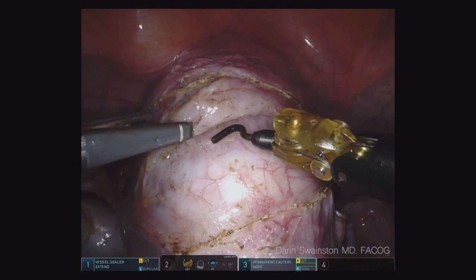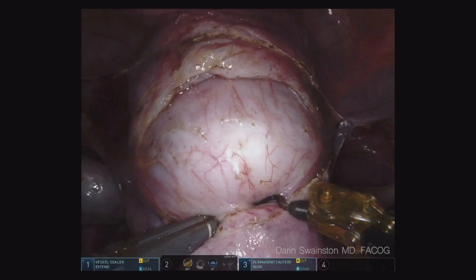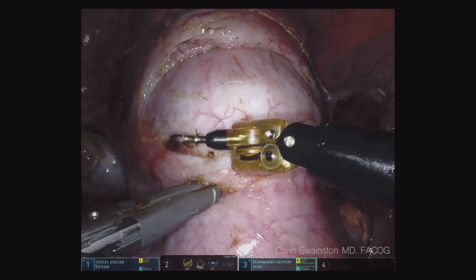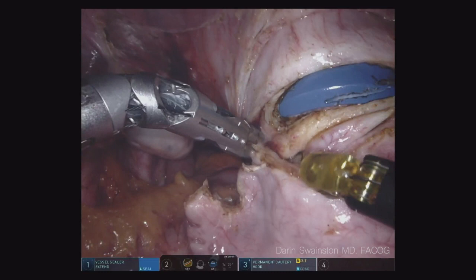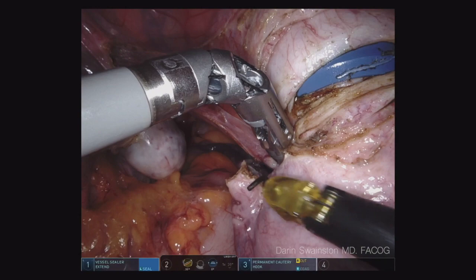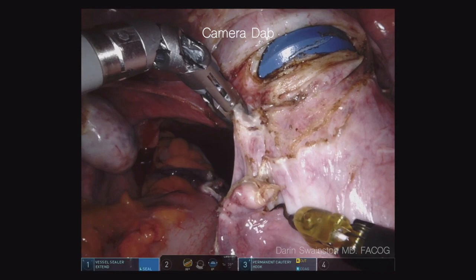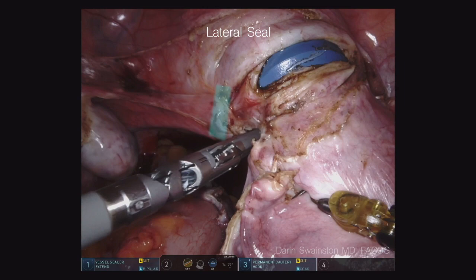I want a lot of space below where I'm going to make the colpotomy. As you can see, that's the colpotomy ring. Then I do a relief cut just like I did underneath. There are some anterior vessels that go right along the 10 o'clock and 2 o'clock. I use monopolar energy only. Once I create that relief cut, I can use that vessel sealer extend to slide over the colpotomy ring. Anteriorly, I like to go lateral seal without cutting, and then I go one width in and do a medial seal and cut. This is safer when you have those vessels under so much tension.